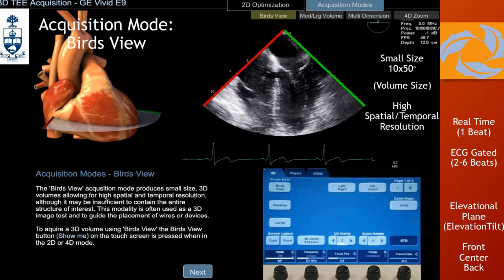The bird's view on GE is close to what live 3D is on Philips. It's a short sector — 50 degrees — with only about 10 degrees of elevational depth, though you can always increase it. You have the volume control to adjust how much you want. It's normally used for seeing close structures or for procedural guidance. Same features as Philips: front, back, and center by default, and you can change these and expand or reduce the lateral width.